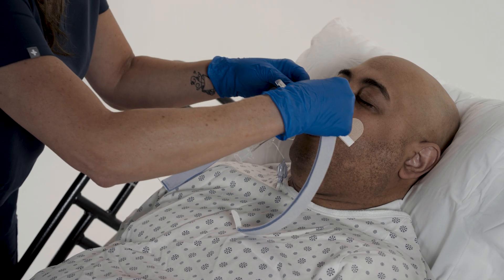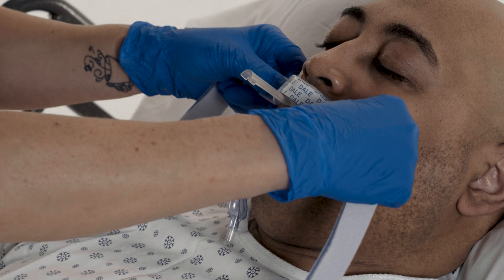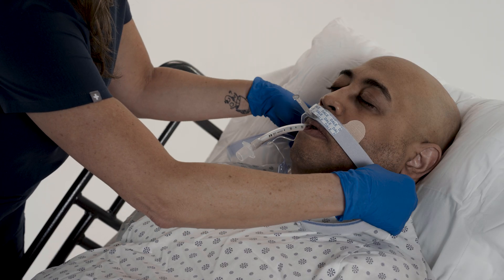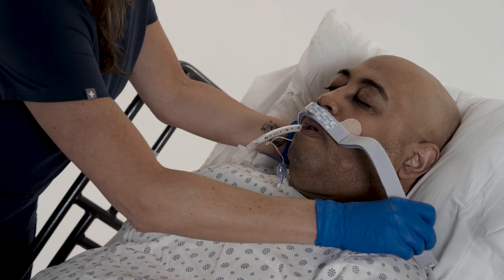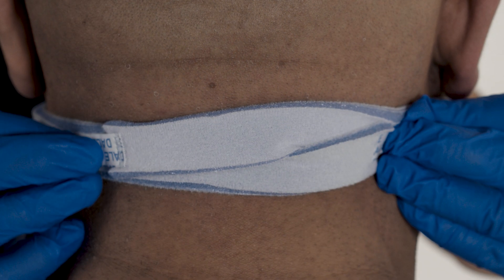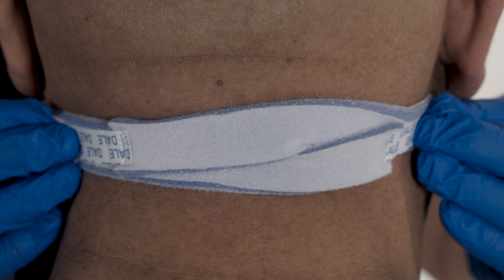Press the neckband onto the hook strip of the adhesive base, making sure the track is centered above the patient's mouth. Draw the ends of the neckband just below the ears and crisscross the band. Press the closures to the outside of the band to secure.